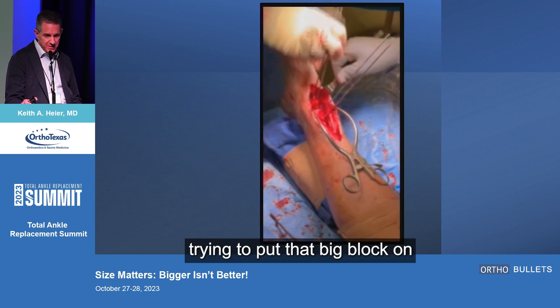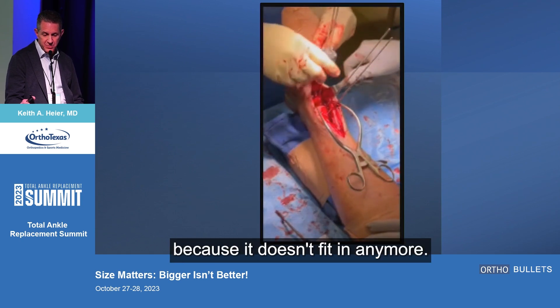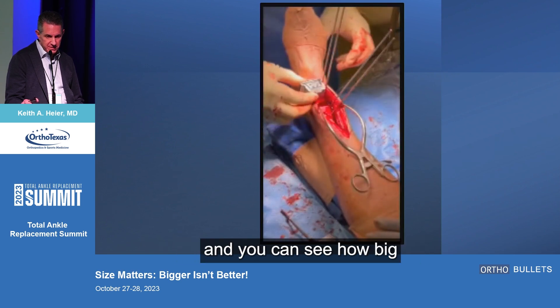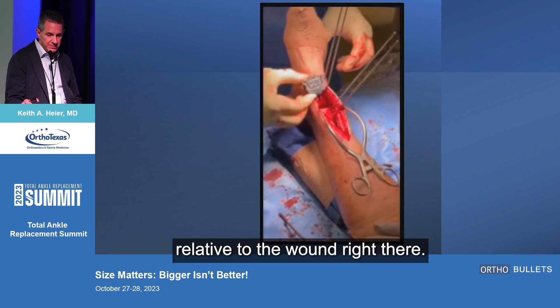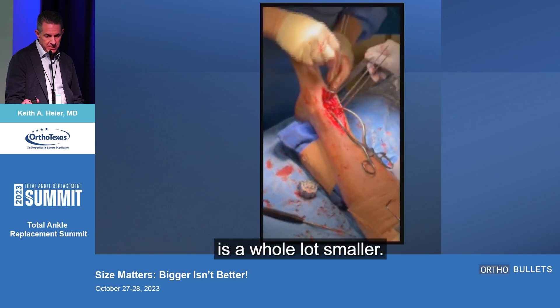This is me trying to put that big block on just to show — but you can't get it down because it doesn't fit anymore. You could put the smaller block on instead, and you can see how big that is relative to the wound right there. The other block is a whole lot smaller.